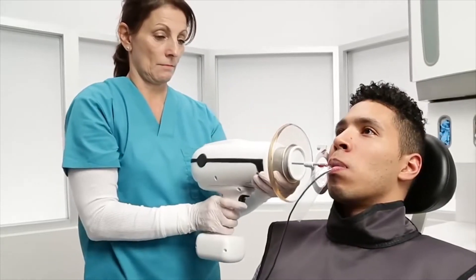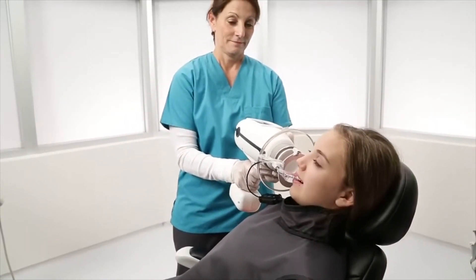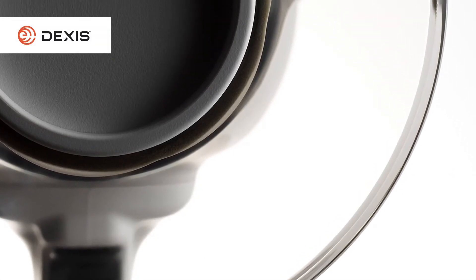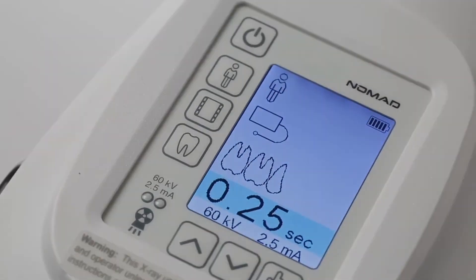With Nomad, there's also an immediate cost savings over multiple operatories. With your new handheld system, you can save the time and cost of construction, wiring, and installation that would be required for wall mount units.